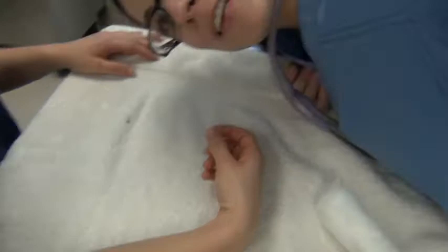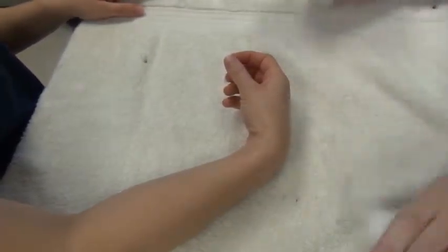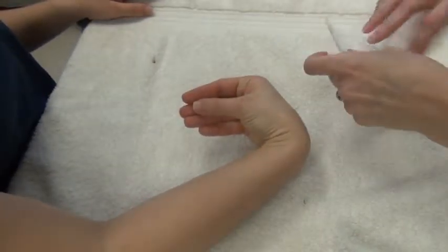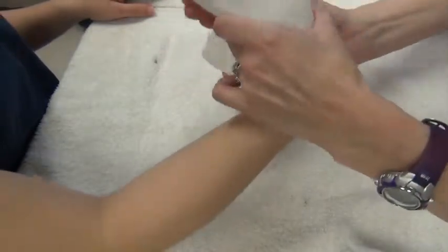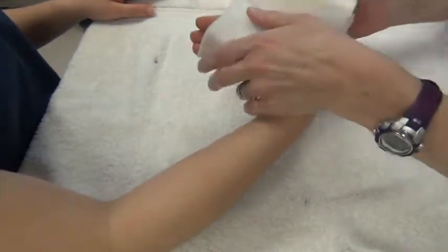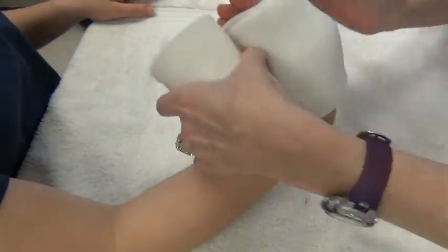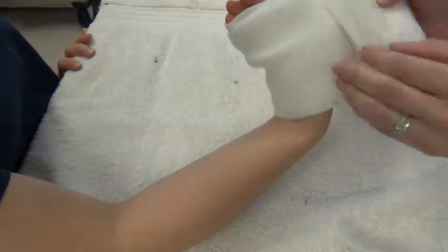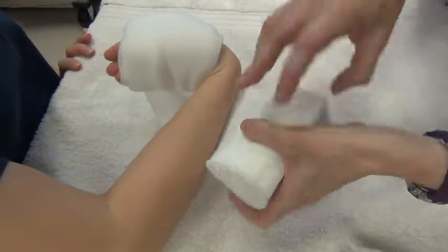Hey, it's Leslie Schmidt. I'm going to apply a carpal flexion splint on Sarah's arm. I did watch the video and I used my text to learn how to do this sling. So we're going to start by bandaging her hand, which would be the dog's foot, obviously, and we're going to leave her fingers, which are the dog's toes, exposed. We're going to wrap the foot and get a lot of padding on it first. Then we're going to start to sling around the bottom of the leg, right above the carpus.